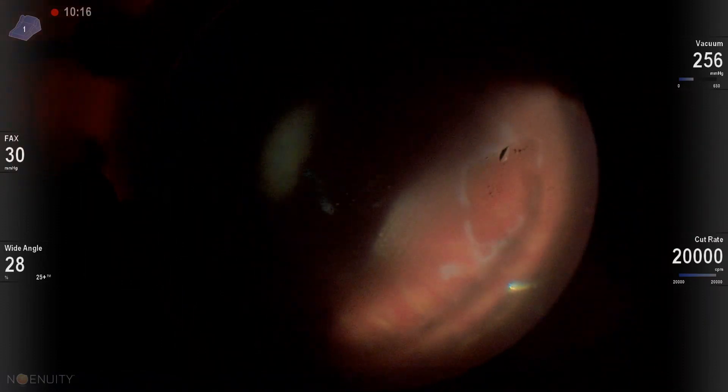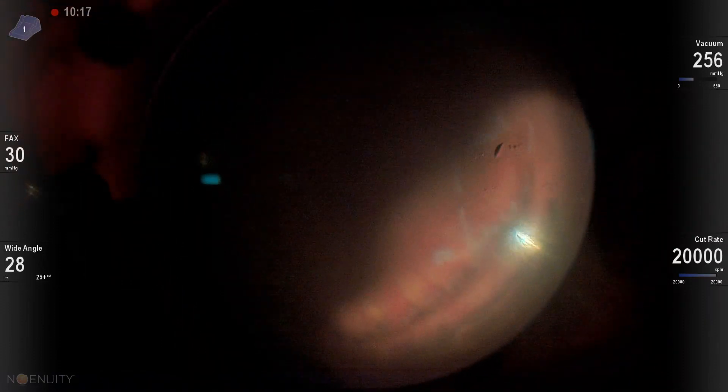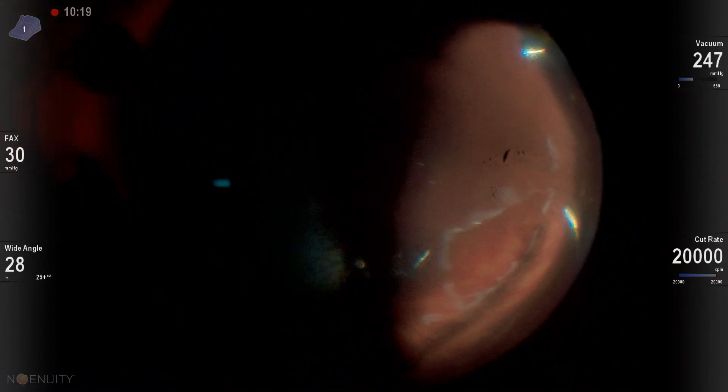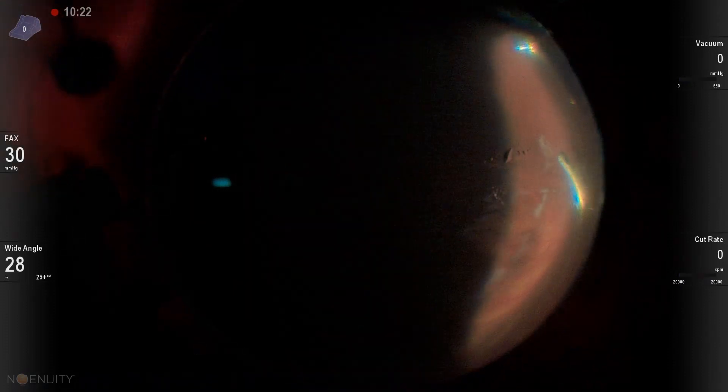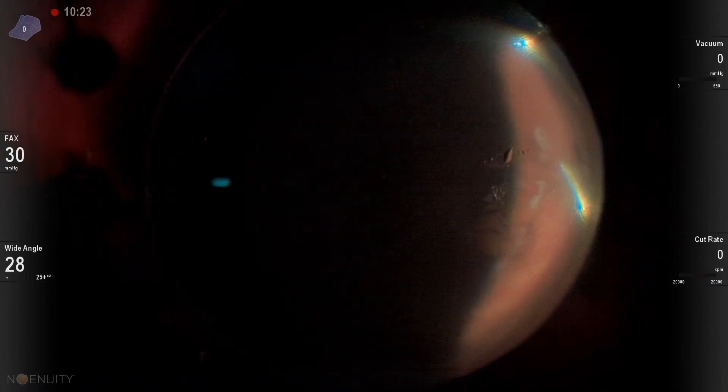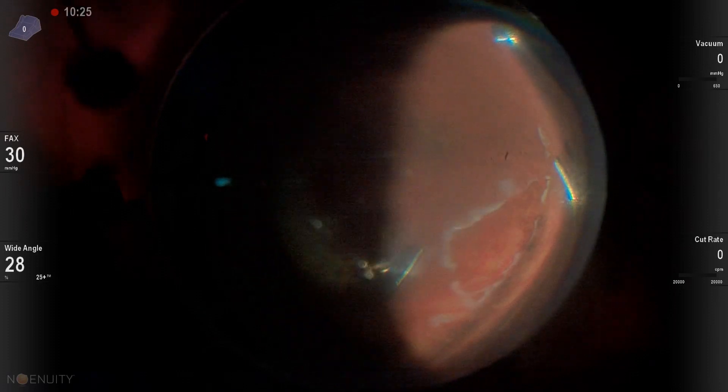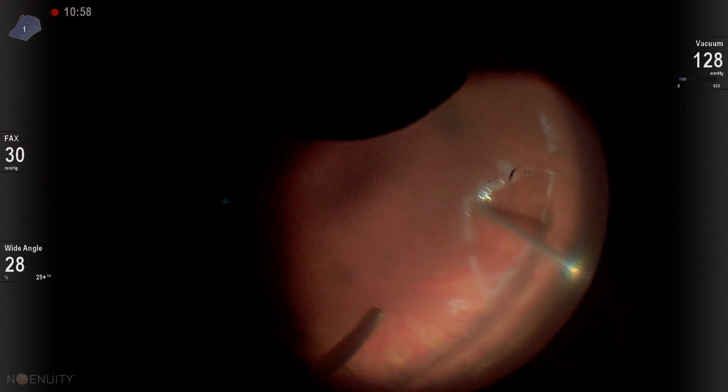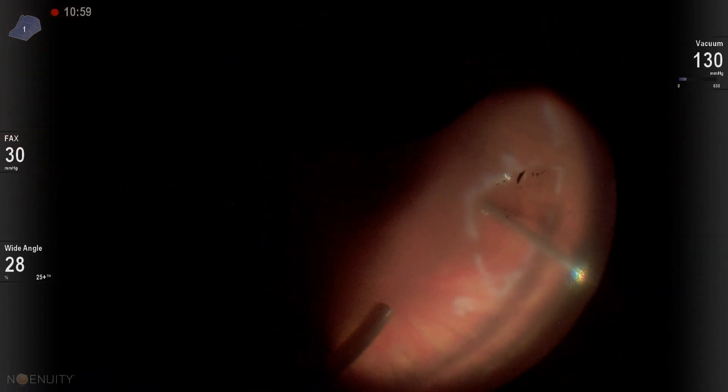We're going to stay right over our break. We're going to roll the eye so that the break is the most dependent part of the eye, so we can get as much fluid to shift over towards that tear. And we're going to do it nice and slow. And since you've got the cutter in the eye, might as well go ahead and do some vitrectomy under air.